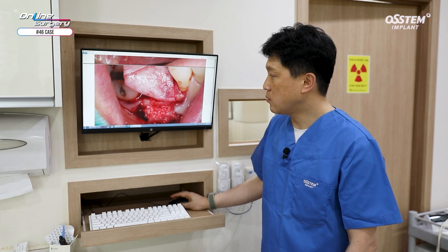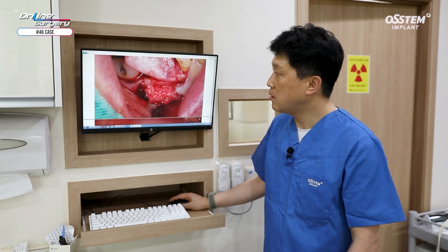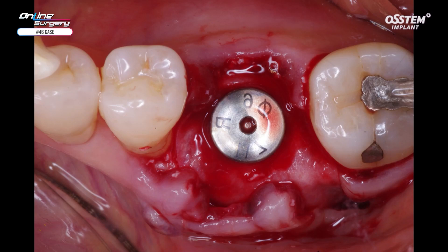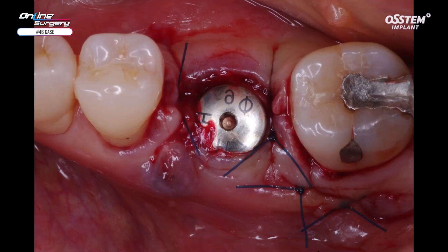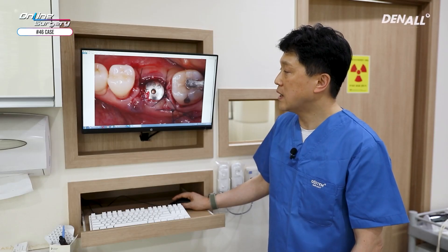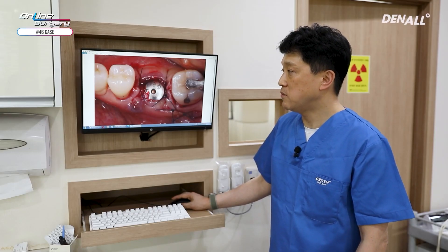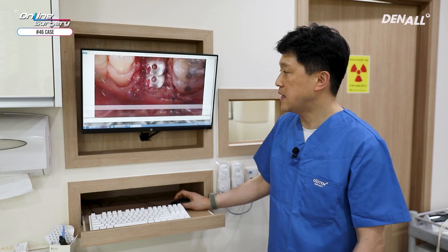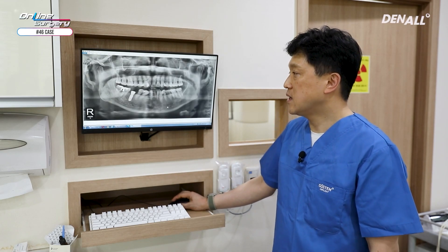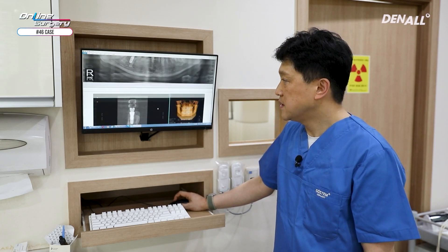The membrane was adapted and two sutures were done. Previously a vertical incision was made to check the fenestration defect, and two sutures were done to close it off. This is the post-op panoramic image, and this is the CT.